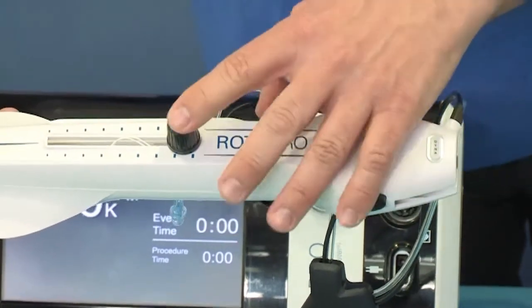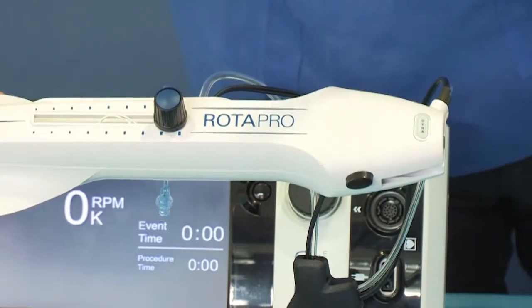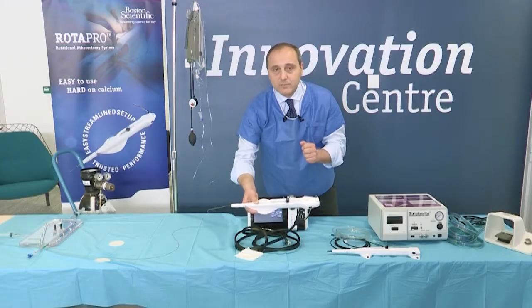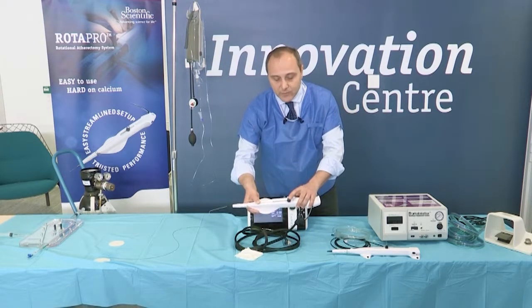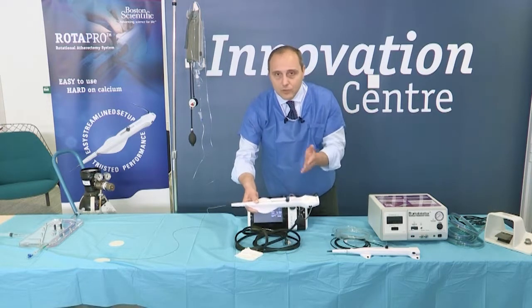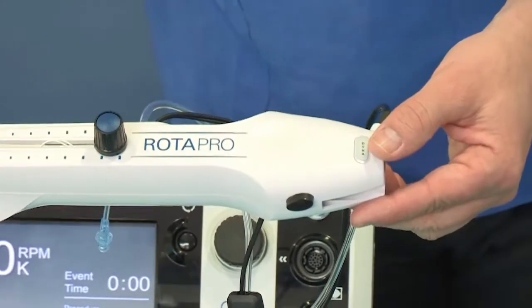Once we are finished, we click again on this, and only then will the motion of the burr stop. So let's remember this important feature. It is not like in the old version, where we lifted up the foot and the motion of the rotablator would stop. In this case, we have to remember to click again on the button to stop the rotablator motion.